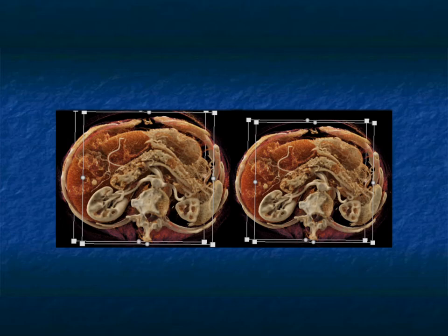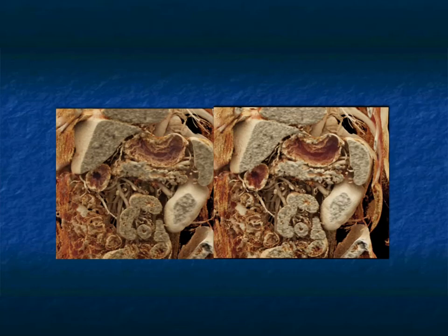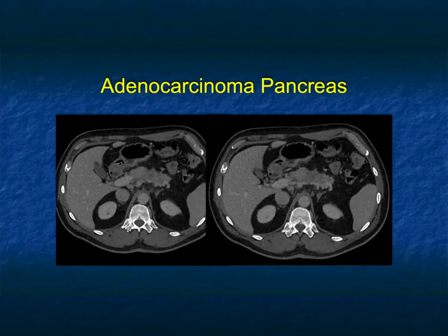As you go further and look at these images, you really begin to understand how good we can do with texture mapping. In many ways, it's similar to radiomics because you're changing the texture of the tissue, or the tissue with texture is different with normal versus abnormal tissue. There's a range of variations. Now, the challenge with cinematic rendering, particularly you see when people try to do it and they are unsuccessful, you have an infinite number of parameters you can change and create an infinite number of images. How do you pick the best image that shows the pathology?